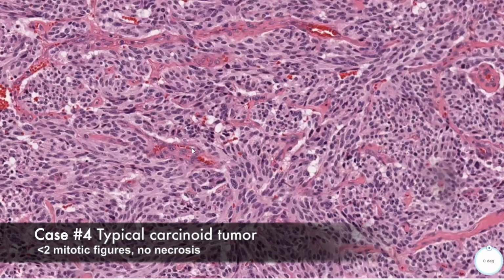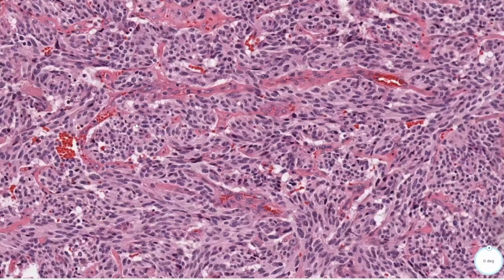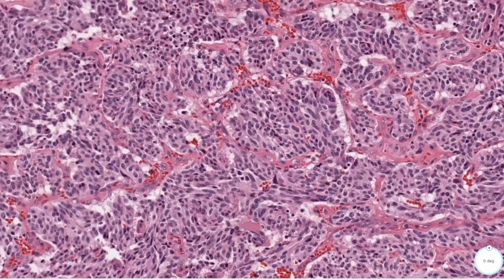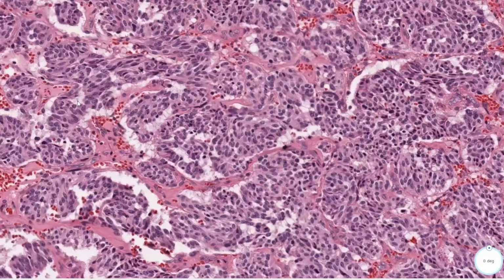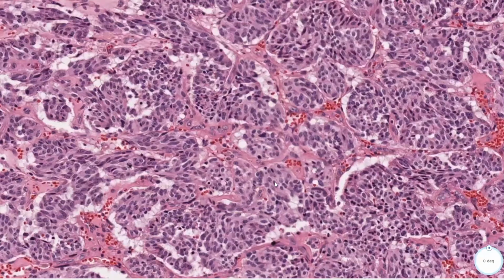Atypical carcinoids have between 2 and 10 mitotic figures. In terms of necrosis, typical carcinoids should not have any necrosis, and atypical carcinoids can have focal areas of necrosis. Once you start getting more than 10 mitotic figures per 2 millimeters squared, you should start to think about a higher grade neuroendocrine tumor, such as a small cell carcinoma or a large cell carcinoma. But typically, these have much more than 10 mitotic figures per 2 millimeters squared. Typically, you're on the order of 50 or more.